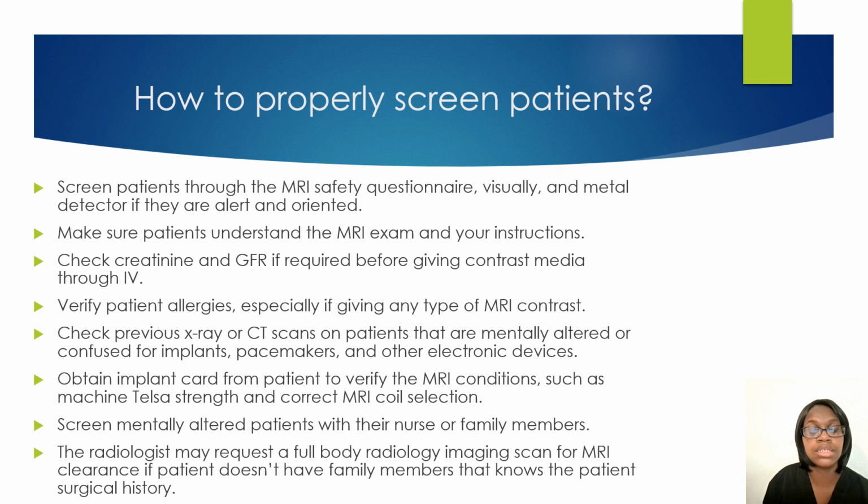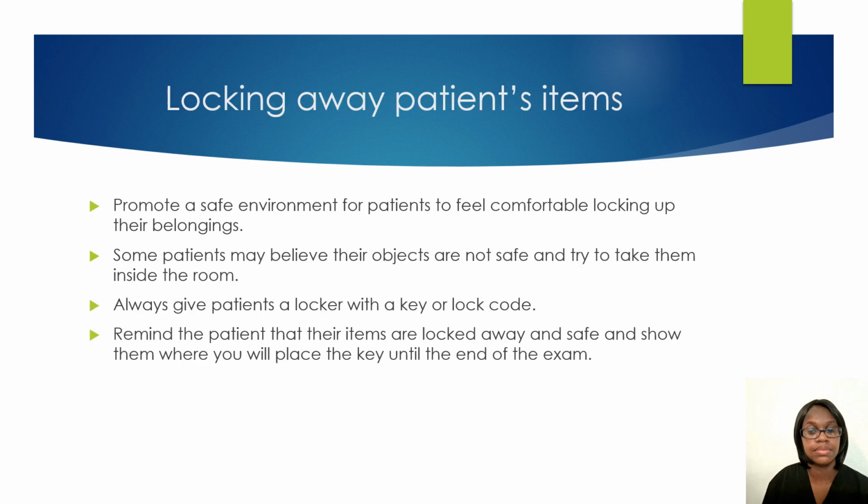Sometimes it is scanned into the system, so make sure you are just covering those steps to protect the patient's safety. Make sure you are locking away the patient's items. This is going to promote a safe environment for the patient to feel comfortable, especially whenever they are doing their MRI scan. You do not want them having their MRI scan thinking about if their belongings are safe. So just make sure that you are locking it inside of a locker.